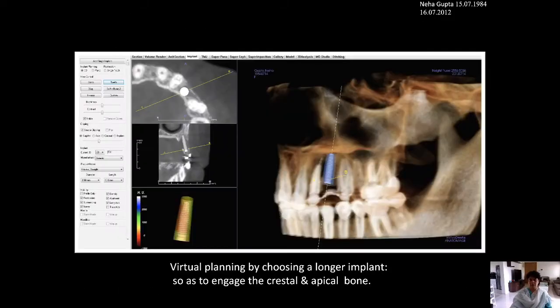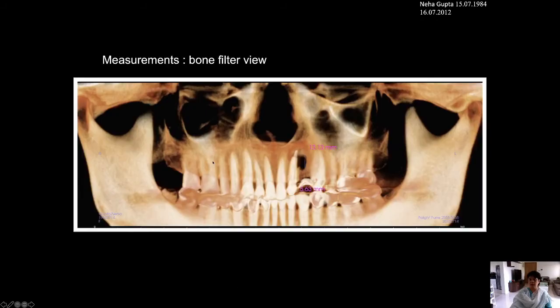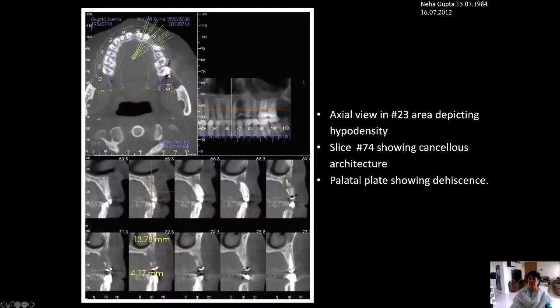So he brought the whole image to me, and the center had done this for him, that okay, you need a long implant. And when I saw this image, I said, Kamal, there is no palatal bone. You can see there is no palatal bone, there is no buccal bone. I really doubt, do we have bone here? Because read this image carefully, that whatever tooth you've kept there, that is the lateral incisor, shows root canal filling. There is also some periapical lesion around it.